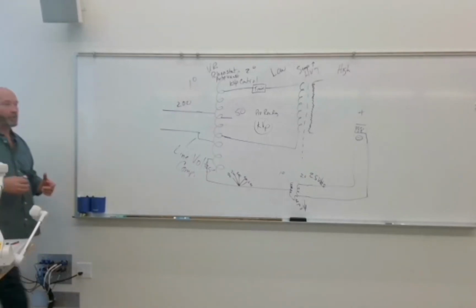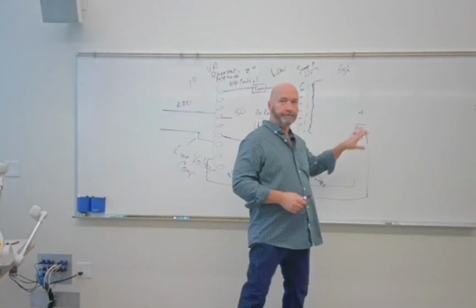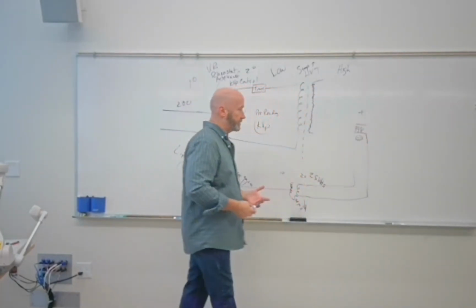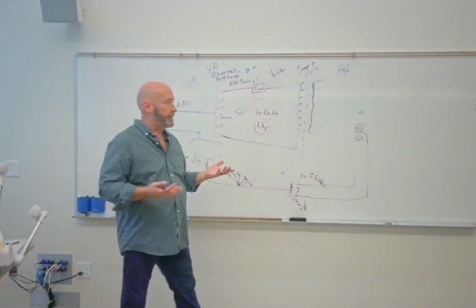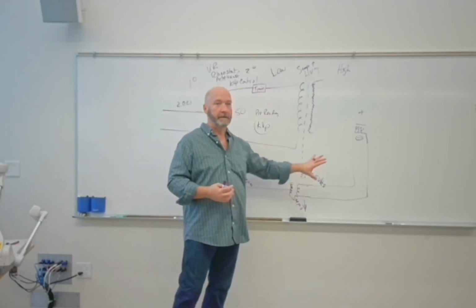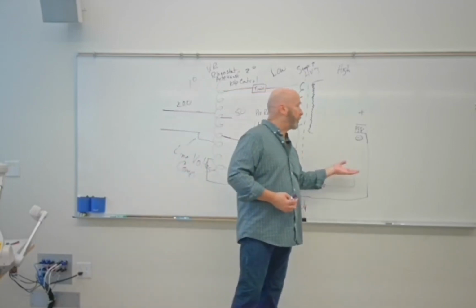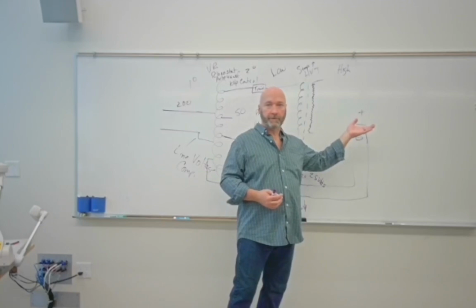Okay. So what that's saying is that you're going to create a space charge, right? You go get all these electrons, and as the KVP goes up, you want to maintain, if you set a certain MA and therefore a certain MAS, the correct number of electrons to jump across the X-ray tube.